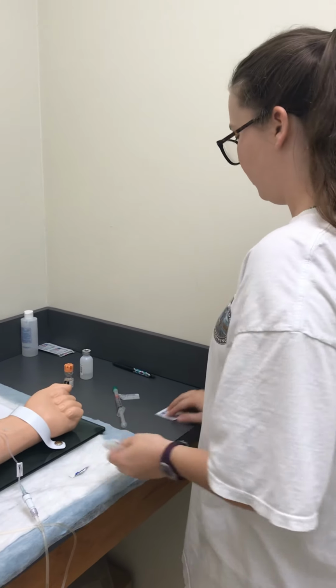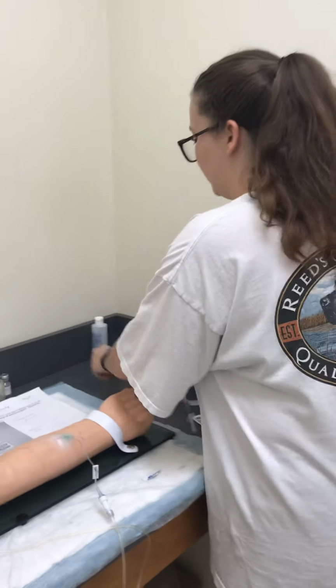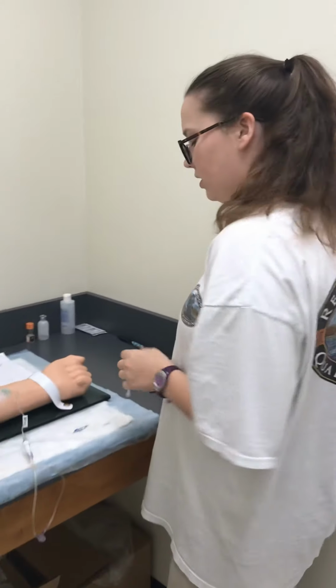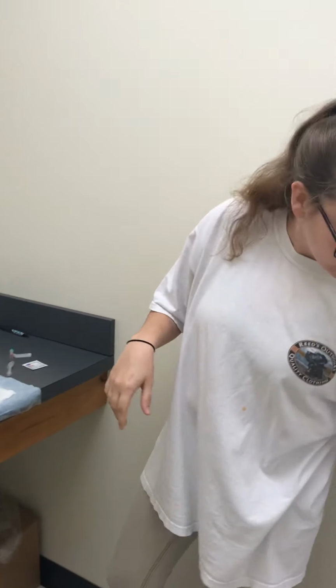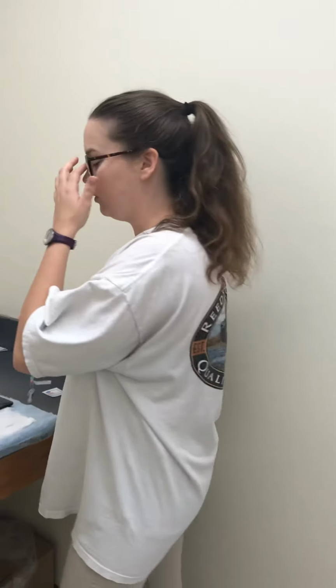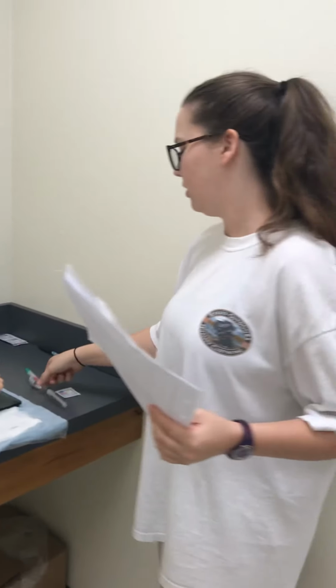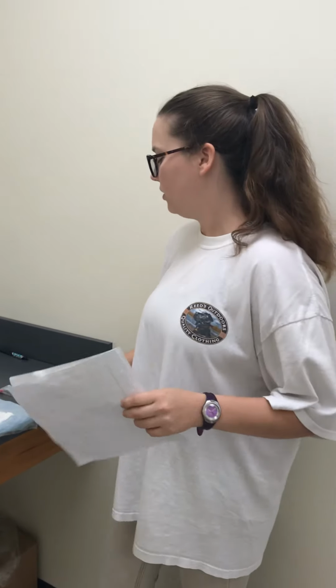Okay, now I've got everything ready. I'm gonna put my medications back. Got my syringe labeled. Got my alcohol swab. Now I'm gonna prepare to go into the patient's room. Okay, got my medication and my swab. I'm gonna knock on the door, introduce myself.